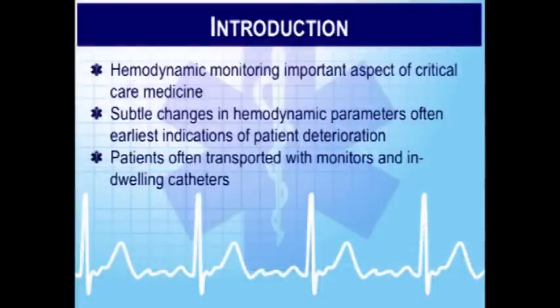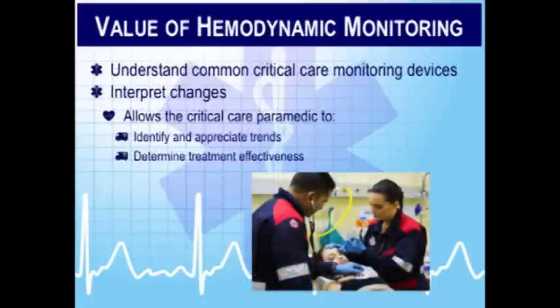In critical care transport, you're going to be getting patients that have these lines in. You're going to be required most of the time to keep an eye on them during transport and how to handle them safely, all right? So the idea is that I want to introduce you to some of these different numbers that maybe you haven't ever been exposed to before, so that you can learn to interpret them and maybe think about how you could intervene on a patient before they actually become shocky. That is going to be the concept that we're going to work with.